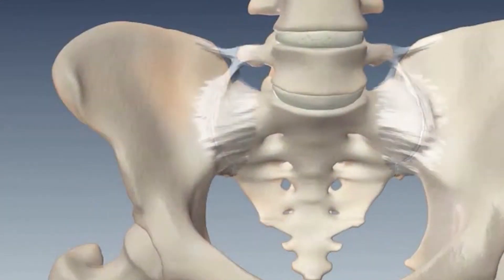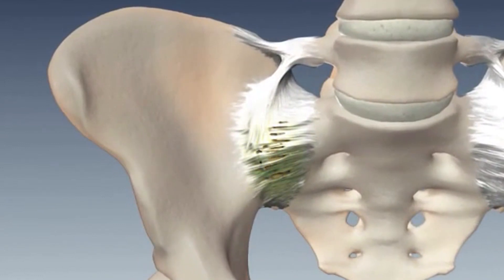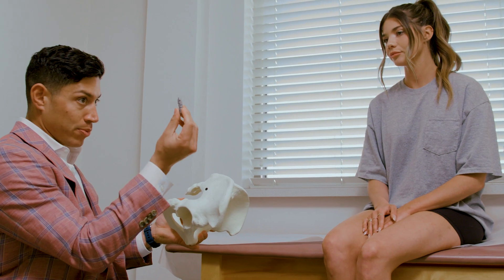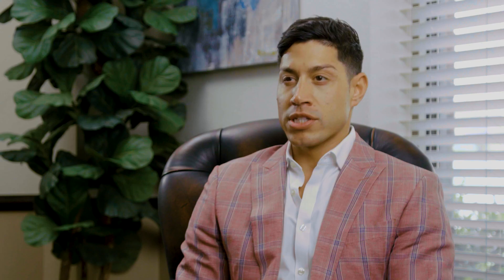Only when these patients have failed non-operative measures do we move towards surgical intervention. When performing the iFUSE procedure, we make a very small one to two inch incision. From there, we place three implants into the SI joint using an x-ray machine. This threaded implant is made from 3D printed metal, which is designed to mimic the actual bone of the body. Therefore, we get quicker bony ingrowth and immediate stabilization of the joint.